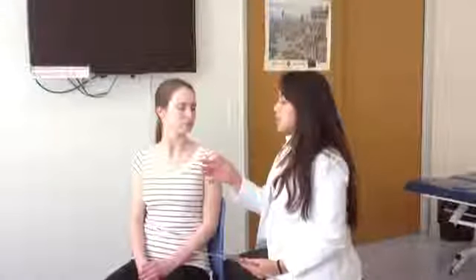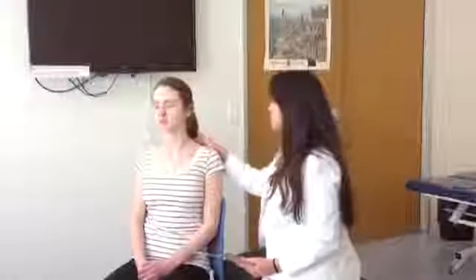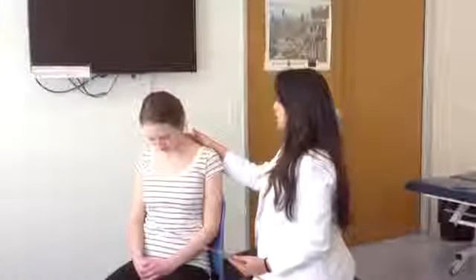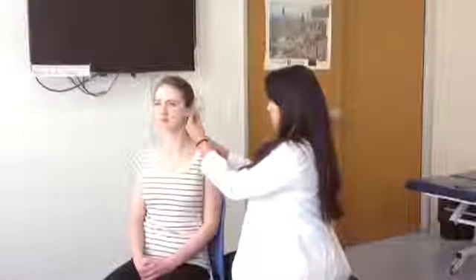Okay. So now I'm going to feel on the back of your spine, just your vertebrae, and what's going to happen is when you're tilting back, when cervical extension stops, the vertebrae right below it, which is your first thoracic vertebrae, is going to move. Okay, and that marks the end of extension. So I'm just going to feel for those processes here. Go ahead and look down. Okay, and you can come back up to neutral. And I'll make sure you're back at 0 again.